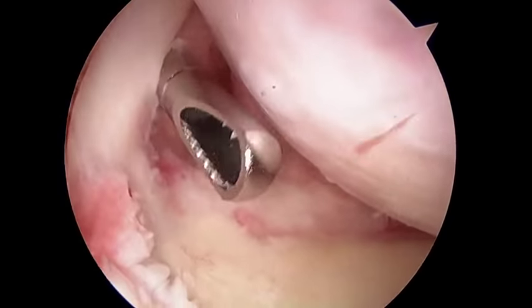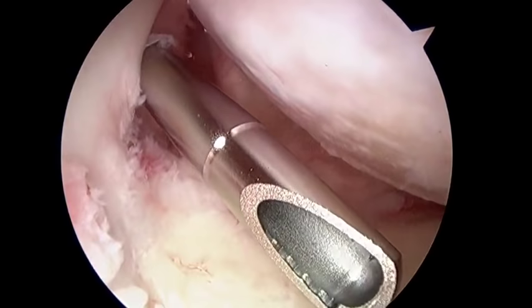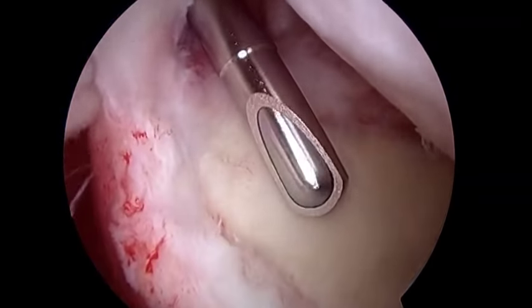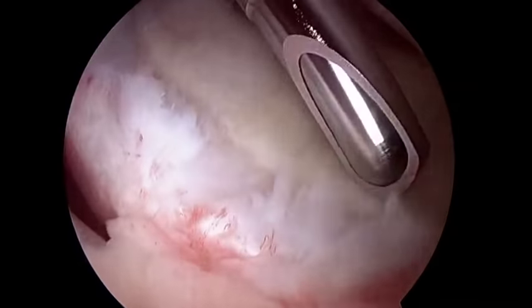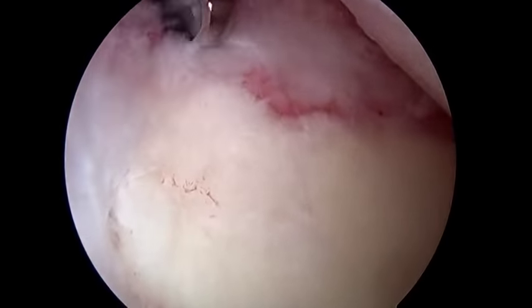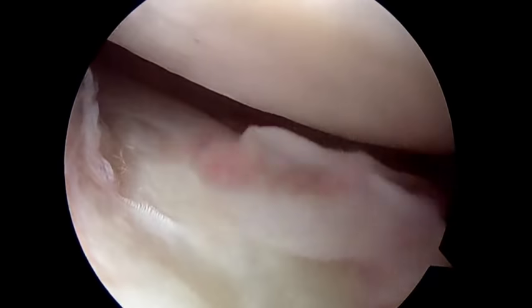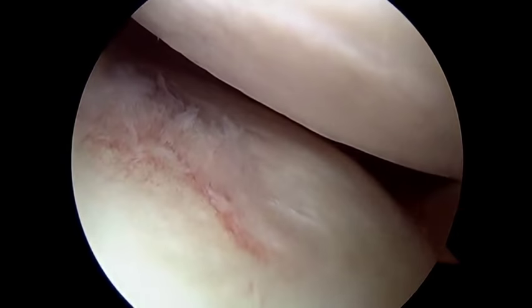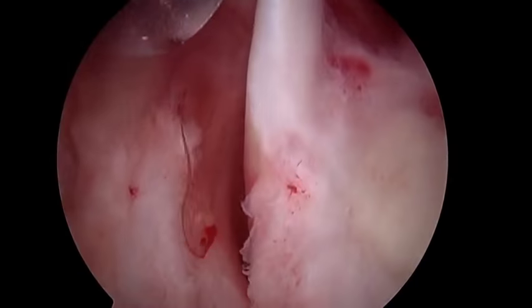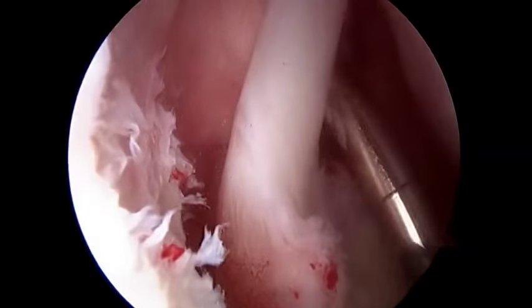So the undersurface of her rotator cuff looks good. She's got a little bit of wear and tear on the humeral head here. A lot of synovitis, erythema in the shoulder. So we're going to clean up the fraying of the labrum here a little bit with this motorized shaver, and clean out some of the capsulitis and some of the scar tissue. As you can see, the humeral head is moving pretty well in what we call the axillary recess. We're just going to get rid of a lot of this scar tissue, which has been limiting her motion. Unfortunately, it just bleeds because it's very erythematous, or red, hot, and angry.